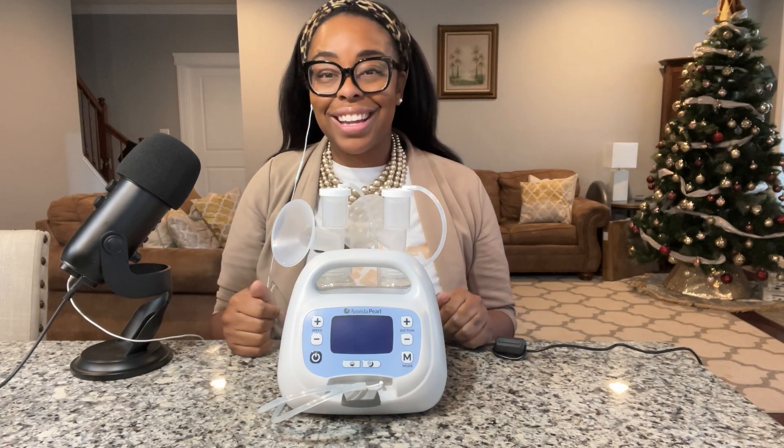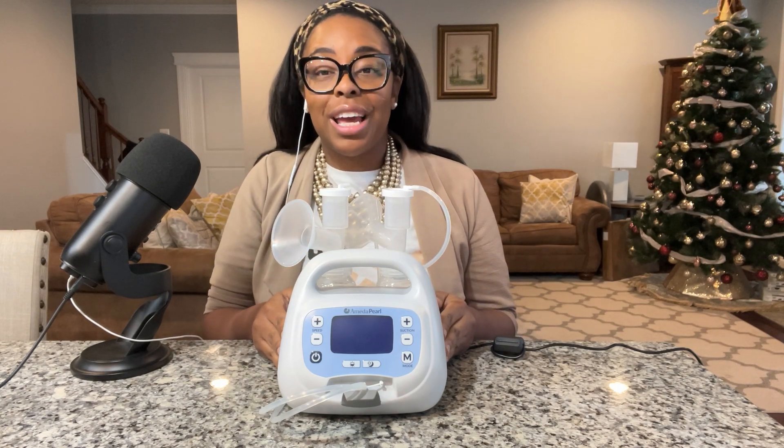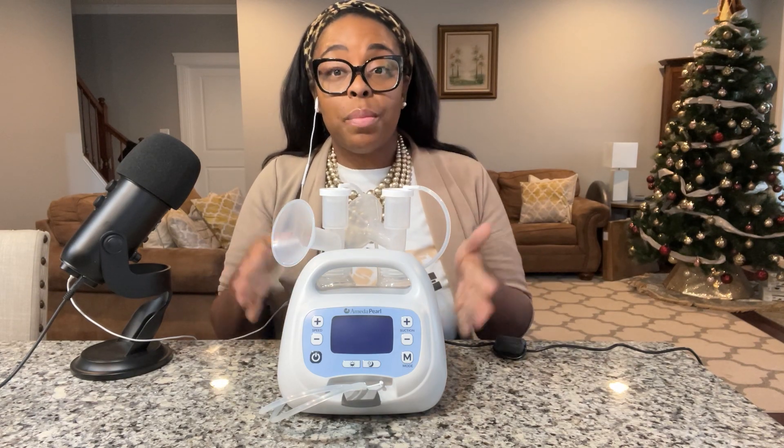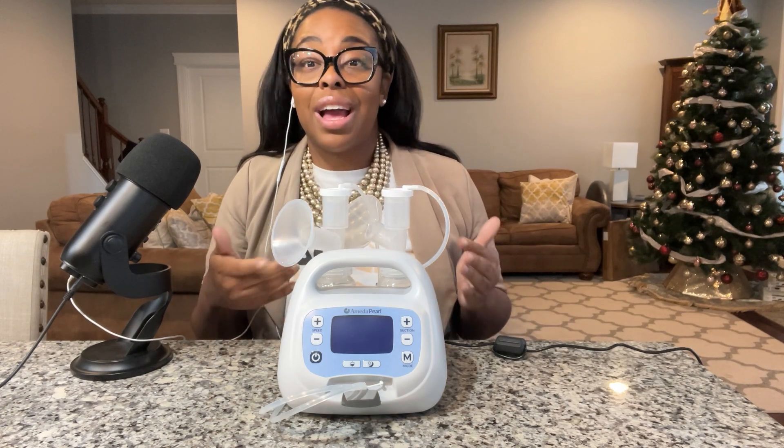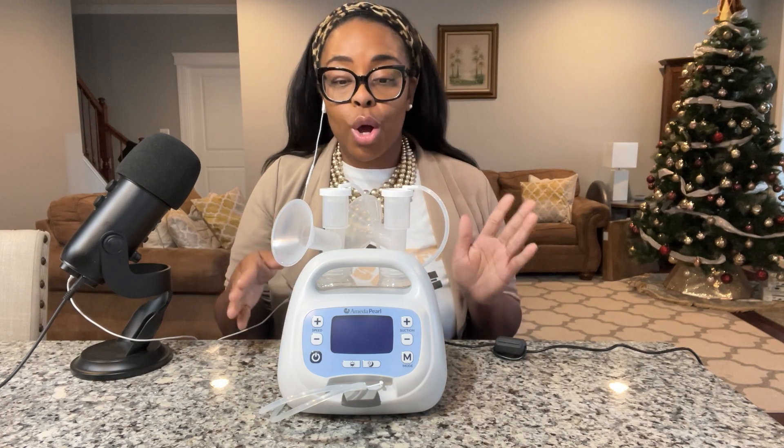Hello and welcome back to Pump with Purpose, this is Dr. Diana. I want to get my full disclaimers and disclosures out up front: I am not an affiliate of Ameda. I purchased this product myself — it retails anywhere from $830 to about $870 depending on if it comes with the pump and parts. The parts were given to me by Ameda when they saw I had made an order, to make sure I had the appropriate parts, but I actually purchased the pump myself.